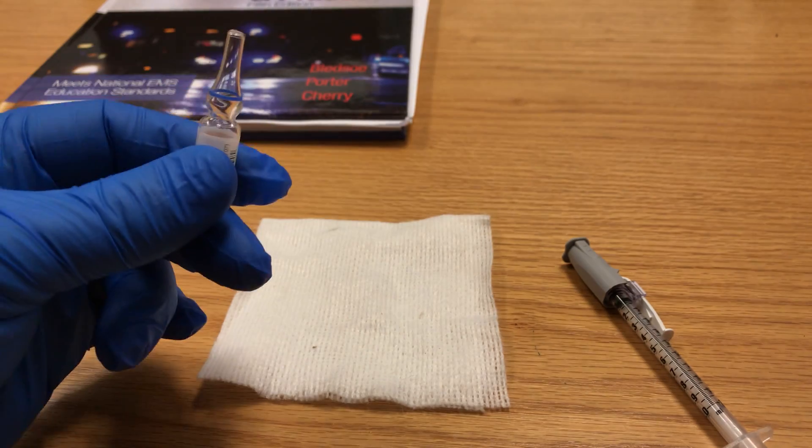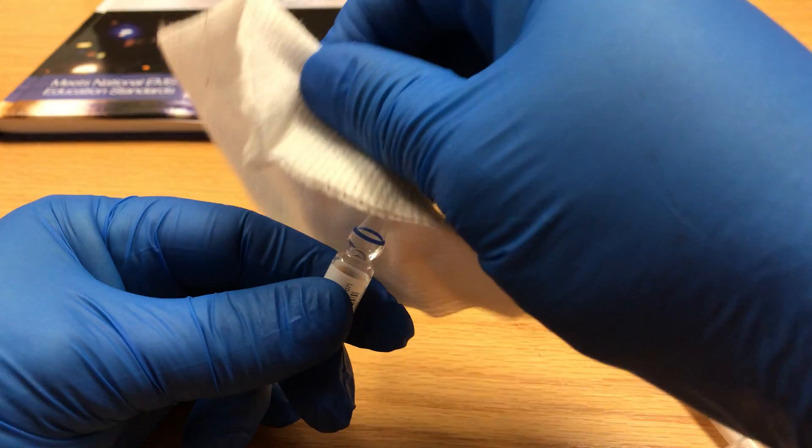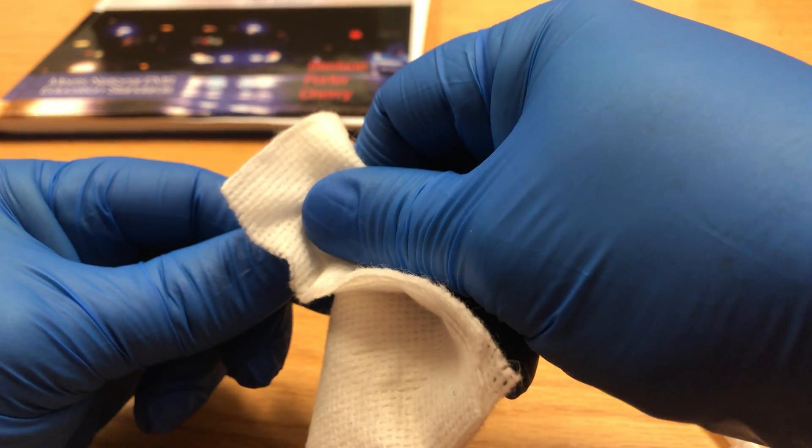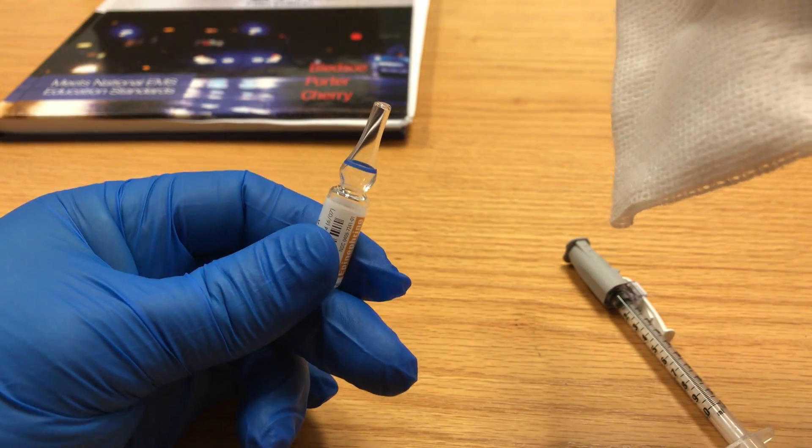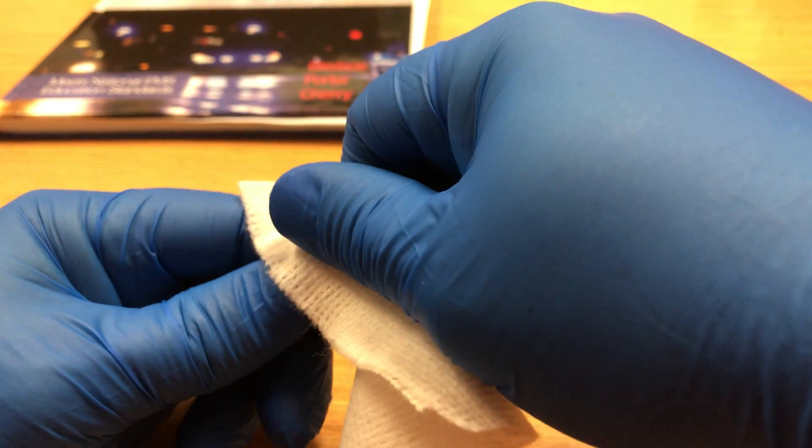I like to use a 4x4 myself, just feel a little bit safer. It's not technically necessary, but I will grab the top of the ampoule with that, hold it with my other hand. The ampoule has a score right across the neck, and that's where it will break.